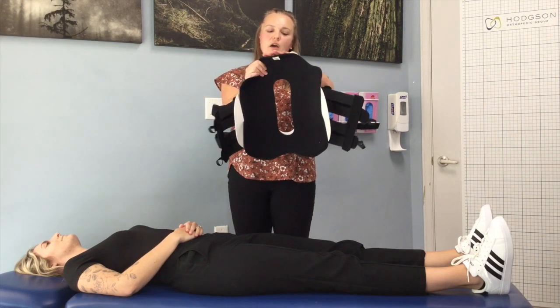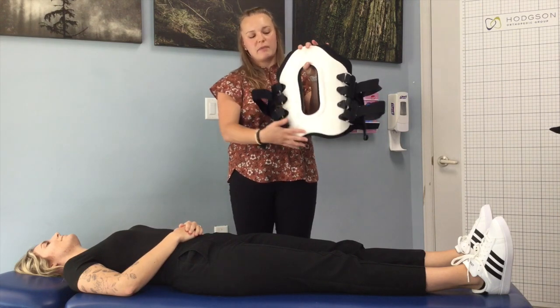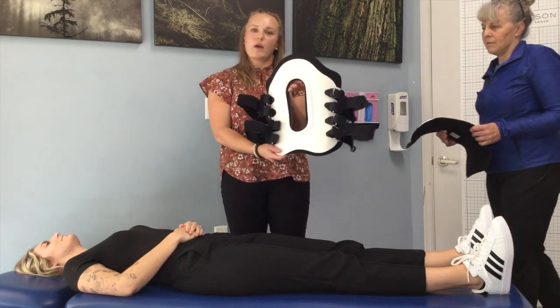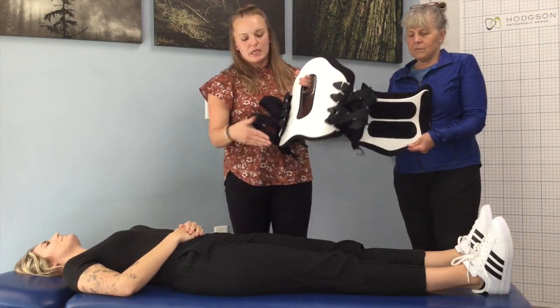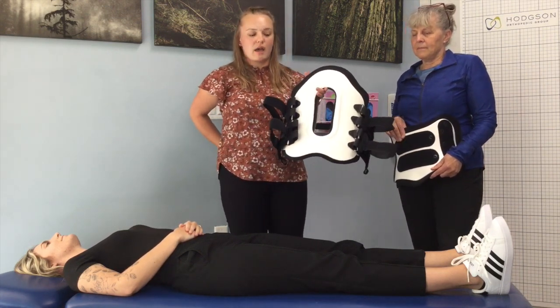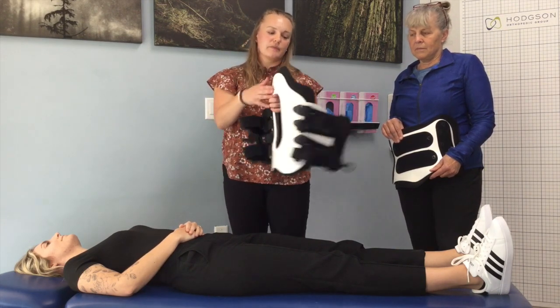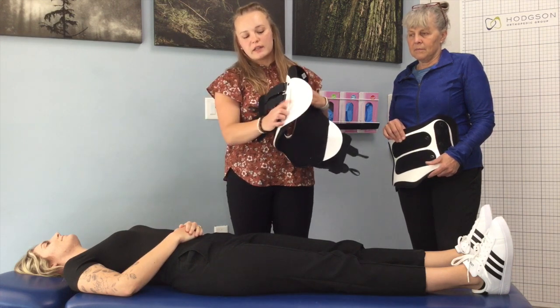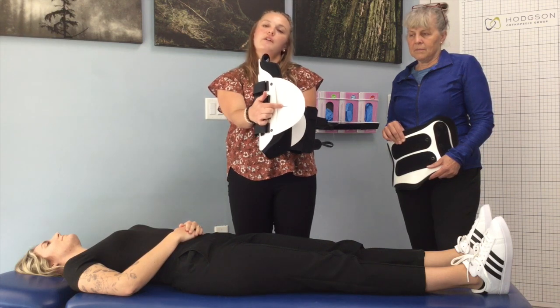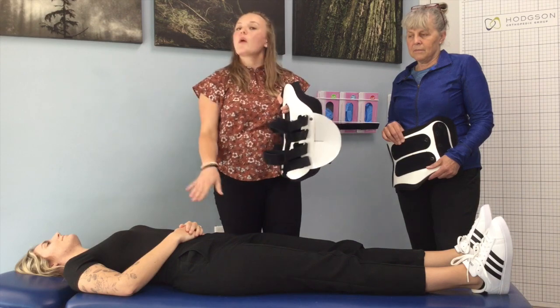It needs to be distinct what is top from bottom, and typically we can help assist with that by writing 'top' and 'back' for patients, staff, and caregivers to understand what is up from down and side to side. The back piece has a cut out for spinous processes and lateral plastic wings. You can see a swoop — this edge rests on the top part of the gluteal region, and this end goes up to the mid thoracic spine. On the lateral flange there is a plastic cutout slit, which is really important for landmarking on the patient's body where their waist is.